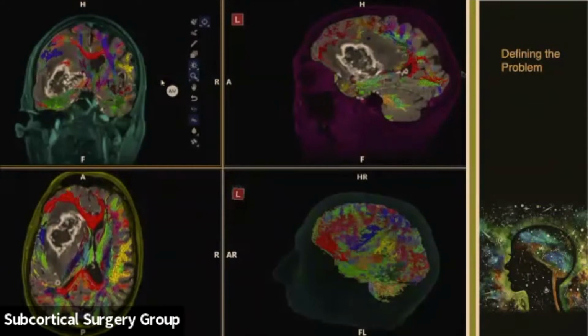And this is the problem, right? That we're very impressed with the geometry of brain fiber tracking. And we can see that the regions which are normal can be very informative. We can see here displacement of the tracts, alteration of the ventricular system, compression of the corticospinal tract, such as there. But in the immediate vicinity of the tumor, it's a mystery. This mystery is the site of the brain-tumor interface.